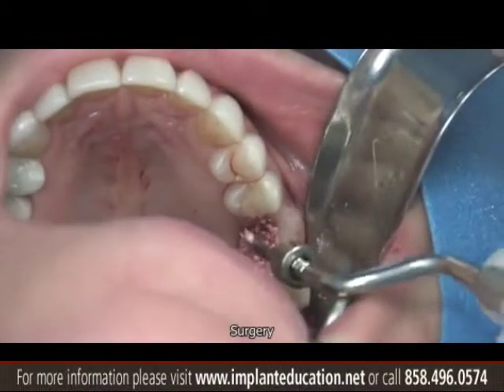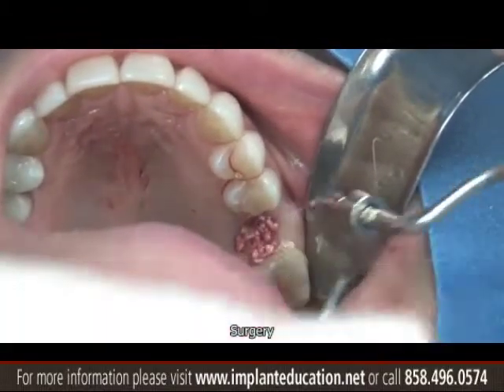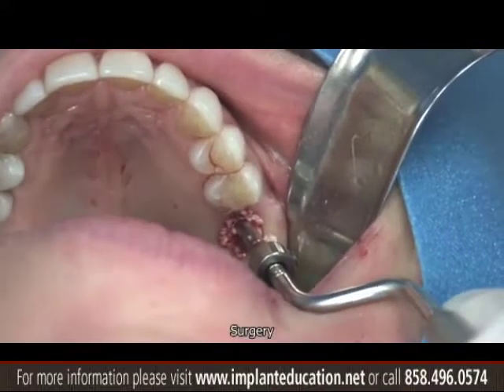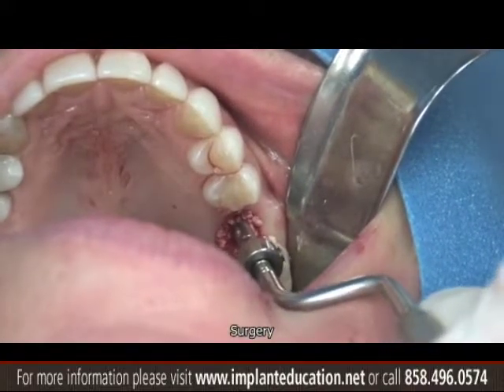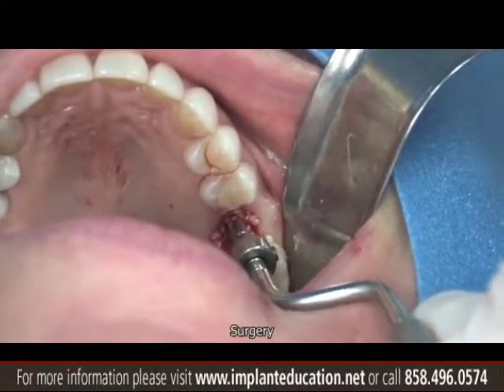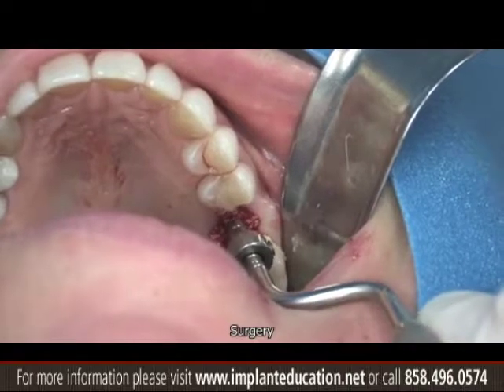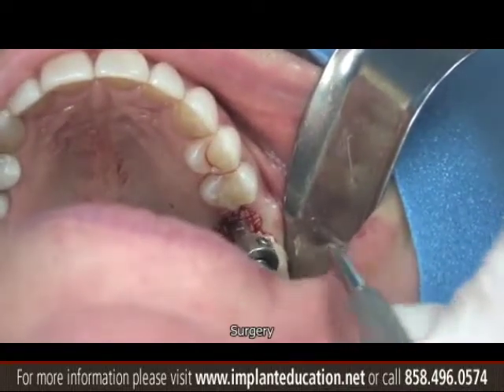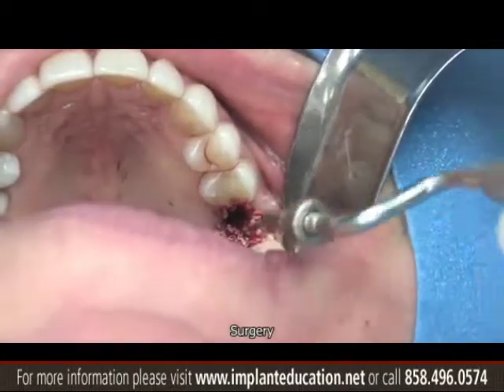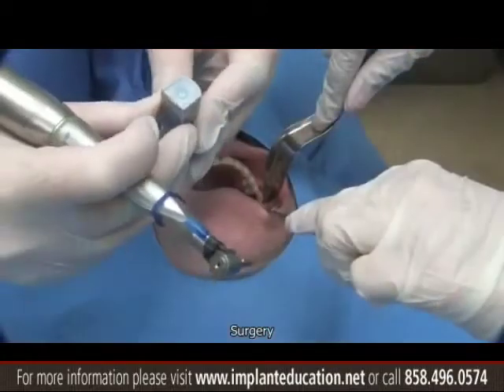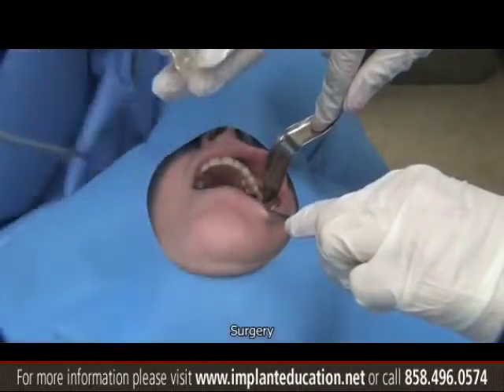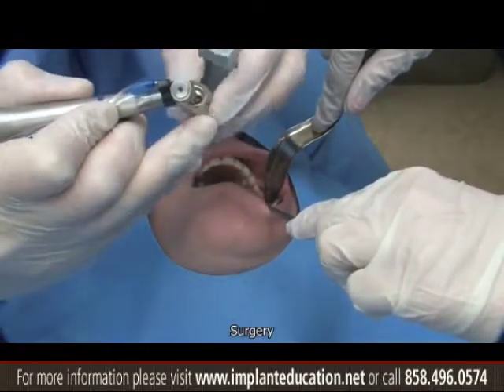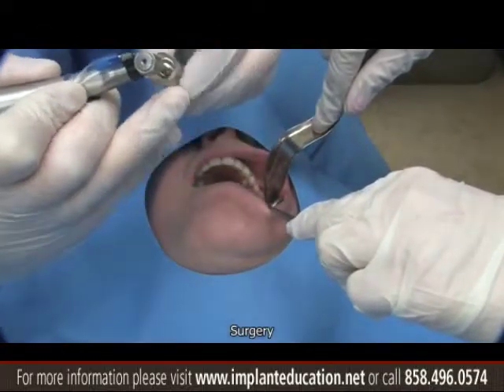As we insert the implant, the collagen and graft will be squeezed and pushed up, and the sinus will be slightly lifted. We can use the sinus osteotome just to gently pack the bone graft and membrane further into the osteotomy. Now we engage the implant with the implant driver — again, 5.3 by 10.